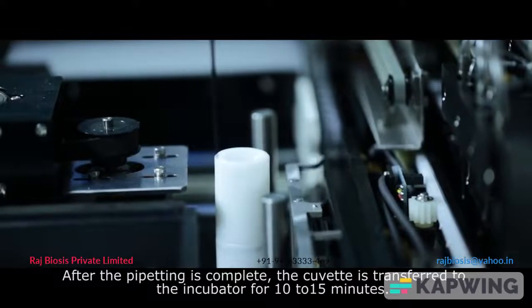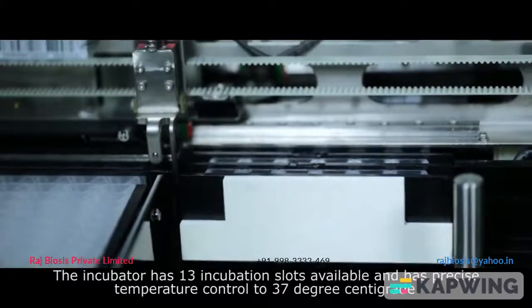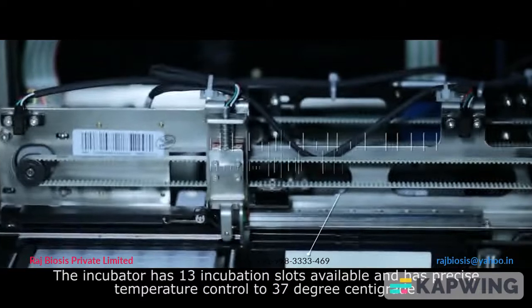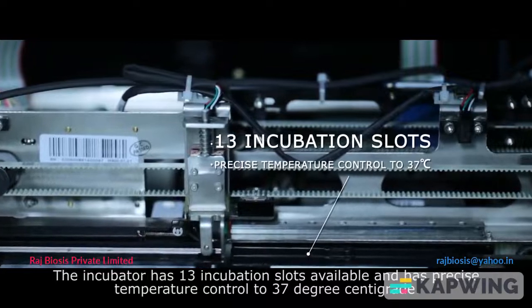After pipetting is complete, the cuvette is transferred to the incubator for 10 to 15 minutes. The incubator has 13 incubation slots and maintains precise temperature control at 37 degrees centigrade.